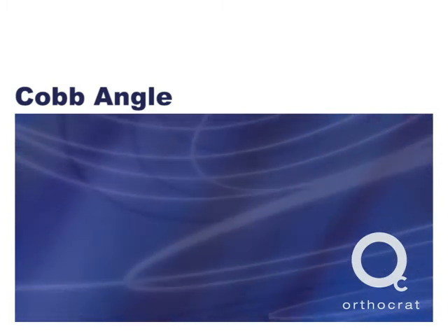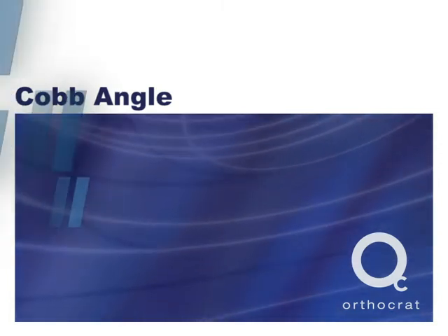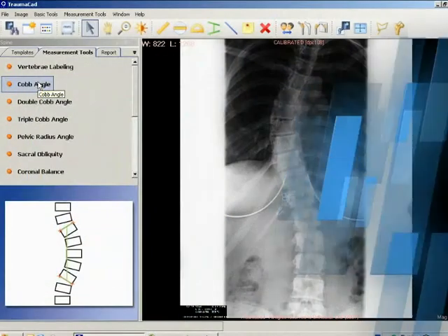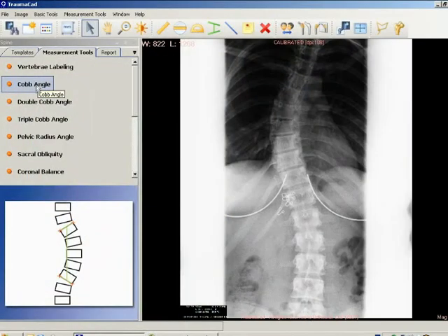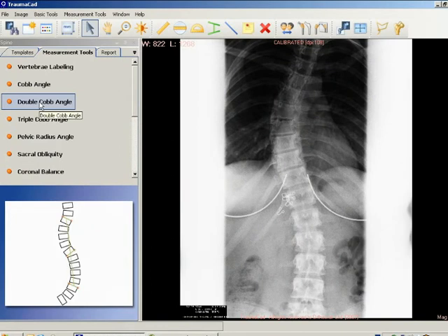Cobb angle. The Cobb angle measurement is used for evaluation of curves in scoliosis on an AP radiographic projection of the spine.